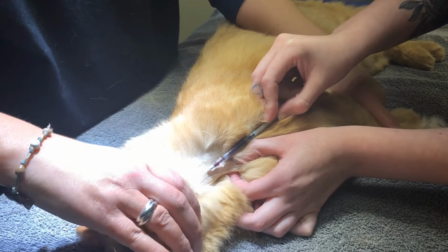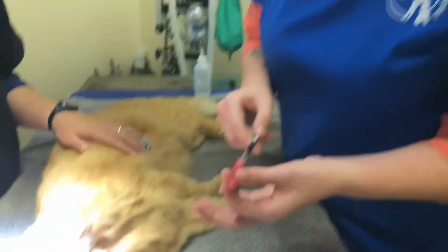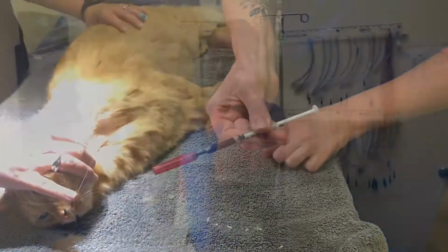When I have my blood sample, I'll let my restrainer know so they can hold off so he doesn't develop a hematoma. And that's our blood sample.